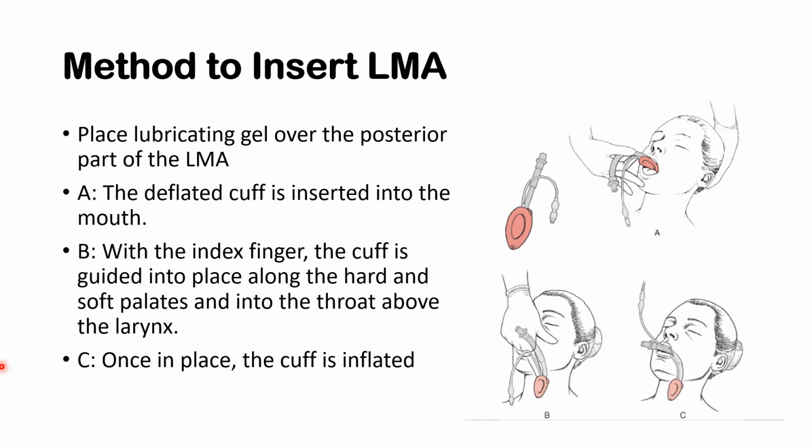Because we prolong ventilation. So that's the first approach. Or you have already tried laryngoscopy but you fail. You fail twice. Oh no way I'm going to get this. Then you go into rescue. So rescue is the LMA. Understand? So you decide as your primary approach.